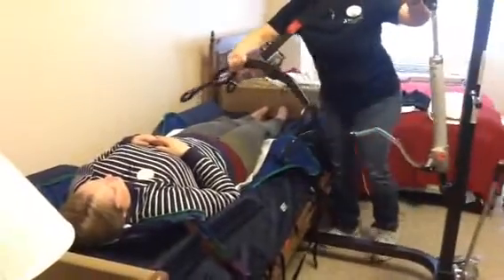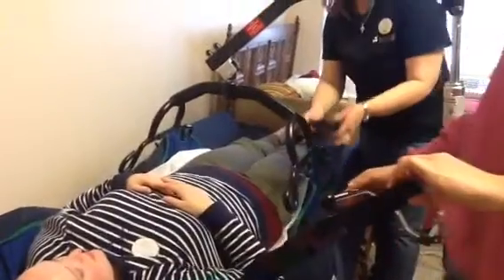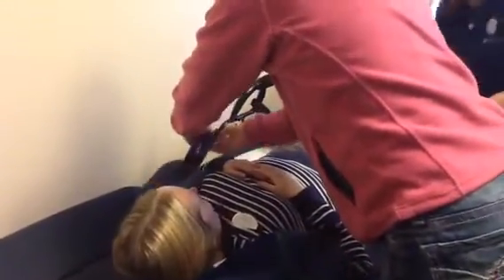So you bring it over and you have your other person come up. We're going to hook it up on the top, and it comes in different colors. This one we're going to use the green, and sometimes it's kind of trial and error. Depends on how well it fits. You might loop it, lift them a little bit, and you might have to put them back down and adjust it. Just see what's comfortable for your resident.